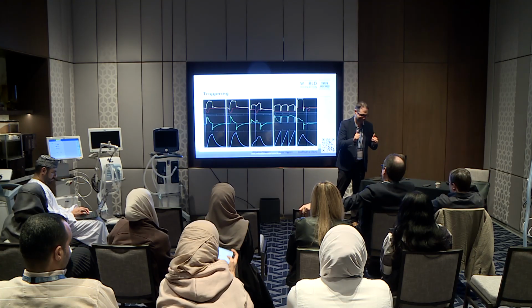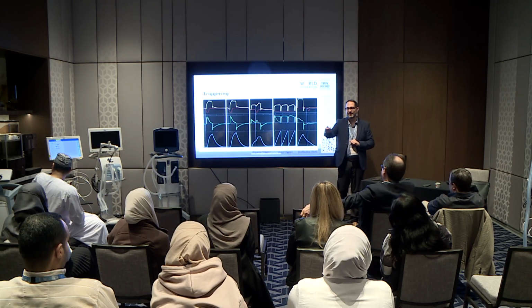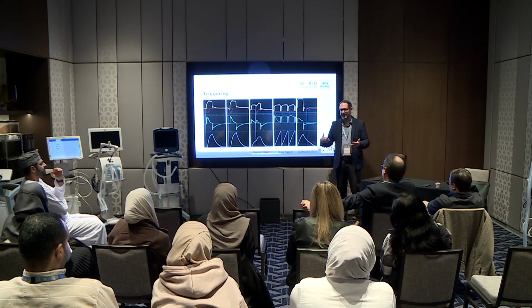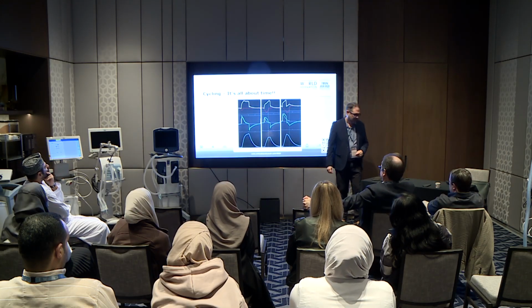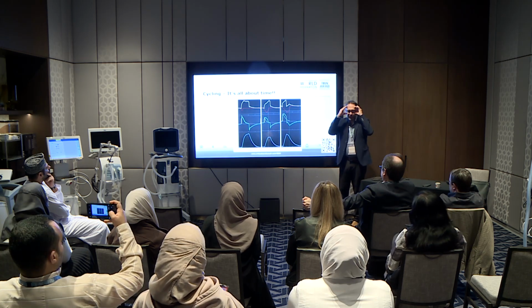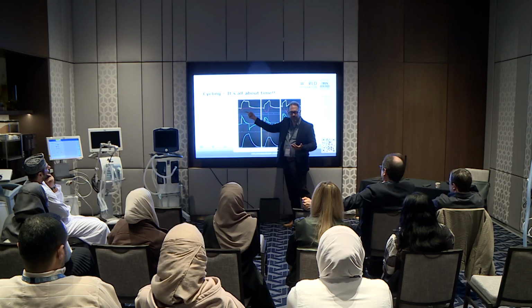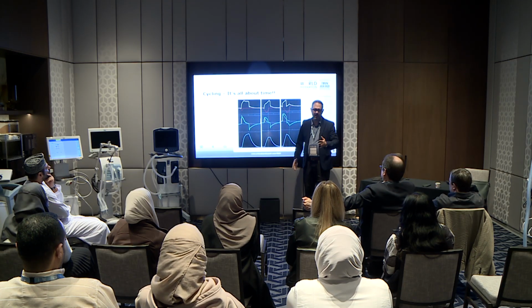Everyone understand? Over the years, I've gone by many ventilators where the trigger sensitivity is set to like 0.1, and you can still see all these ineffective efforts. I clearly understood why they did it. They thought they could get the patient to trigger, but that's not the problem. So cycling is all about time, right? We don't know the neurological time of the patient unless you have something like esophageal pressure. You don't even need to calculate PMUS, but you would see the swing in esophageal pressure. If we see it, then we know if cycling is on time or not.